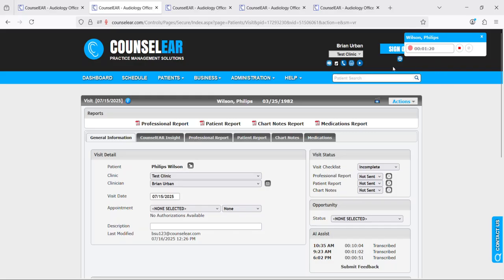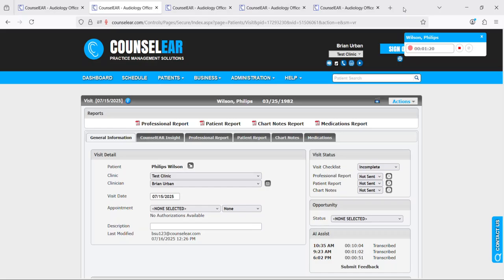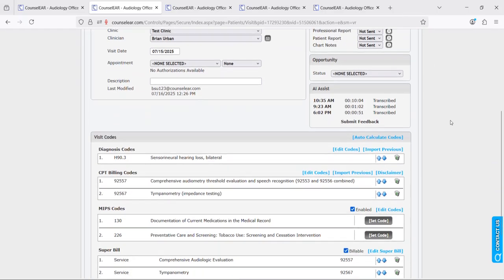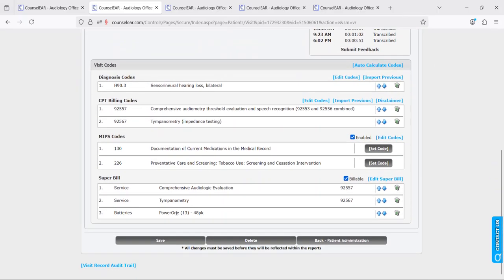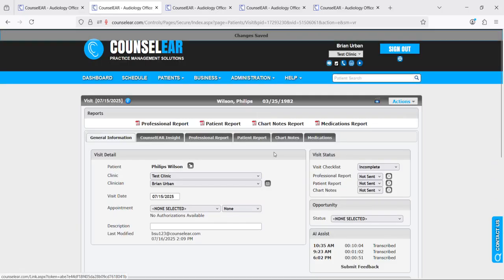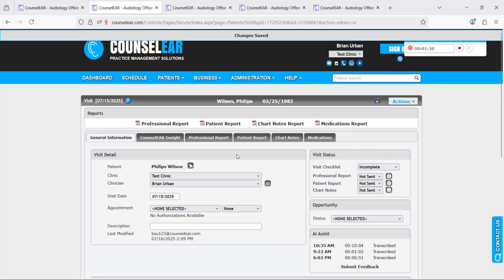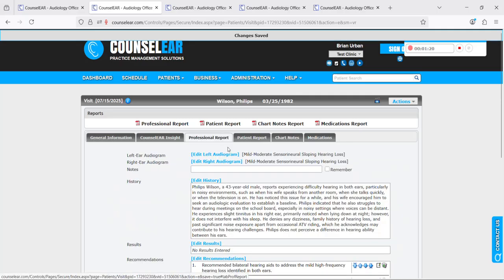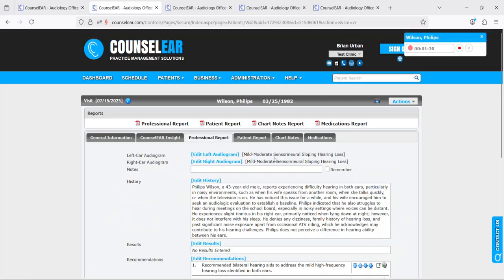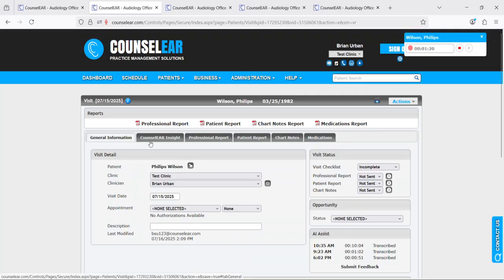So we want to make sure keep the original tab open and when you export the data from Synergy to Counselor it opens a new tab. You can go ahead, you see the data has populated in that new tab, close that tab and then very simply click save here in the original tab and that will bring in all the results. So you'll be able to look over and you'll see the test results that we just populated.